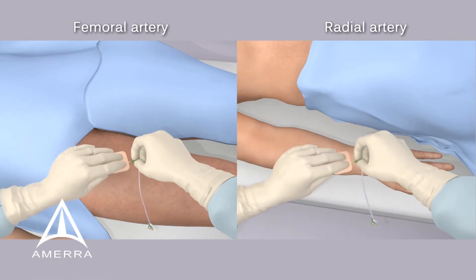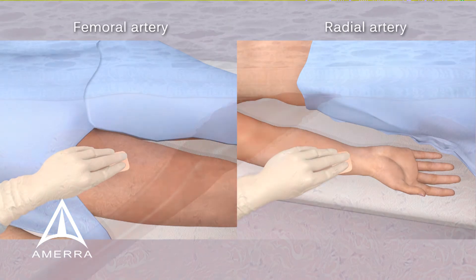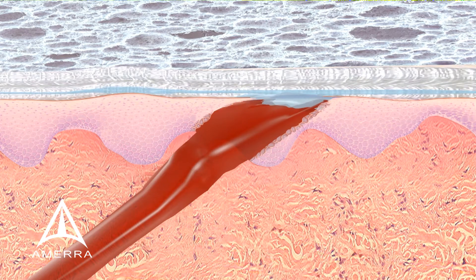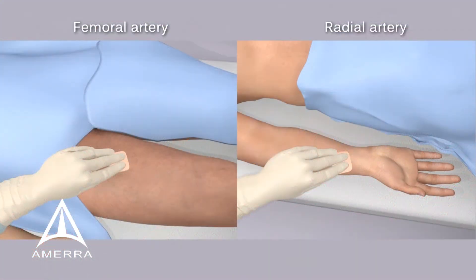Apply to the access site and begin manual compression while gently removing sheath. The hemostatic gauze becomes a viscous gel, quickly blocking capillary bleeding by activating the body's intrinsic hemostatic process. Maintain manual compression for five minutes or longer depending on the patient's needs.